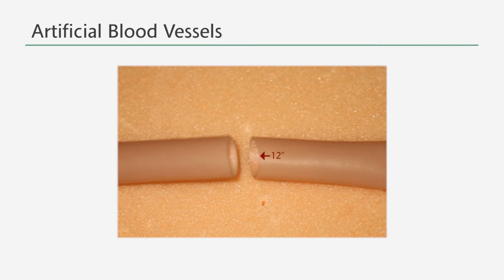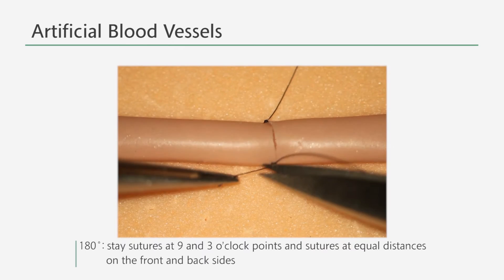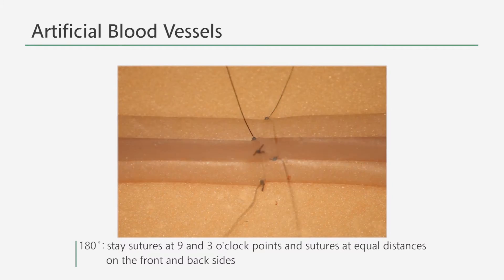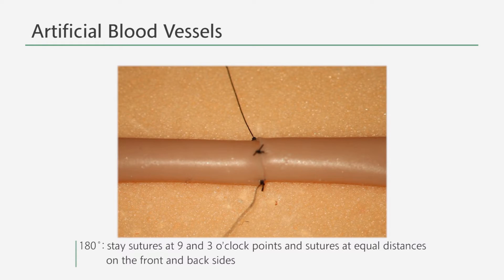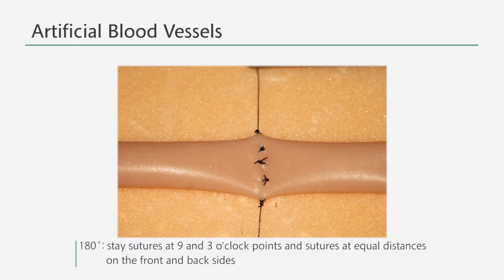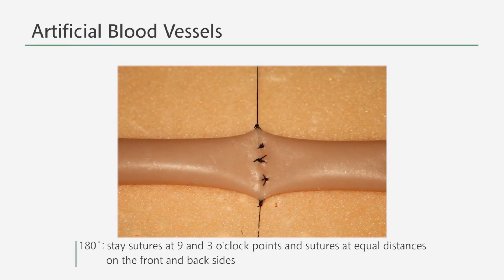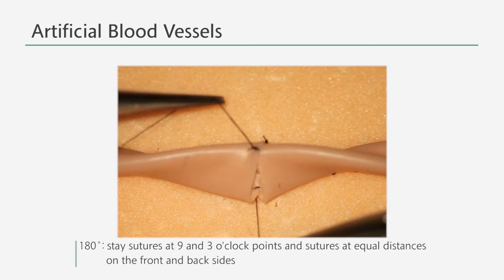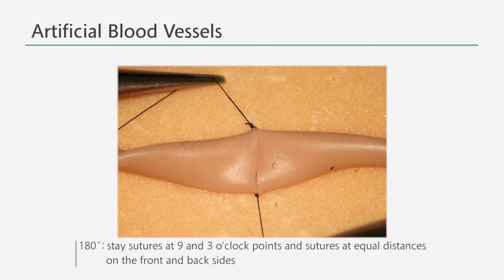If you consider the point on the vessel that is closest to you as the 12 o'clock point, perform the stay sutures at the 3 o'clock and at the 9 o'clock positions. Then suture at the 12 o'clock point and in the middle of the two segments divided by the 12 o'clock suture. Afterwards, turn the vessel around and repeat the same on the other side.